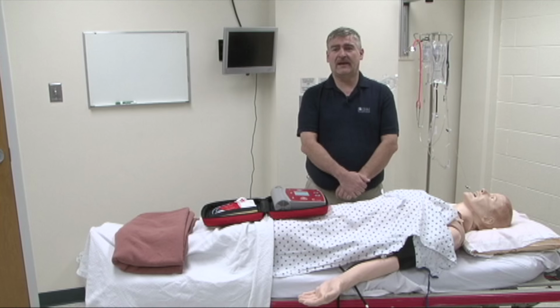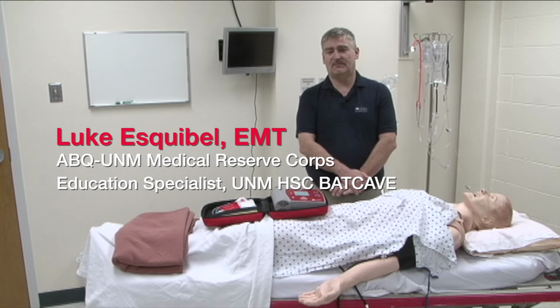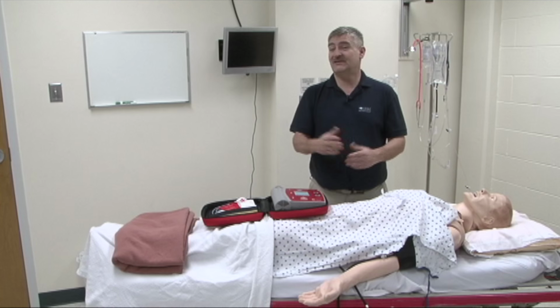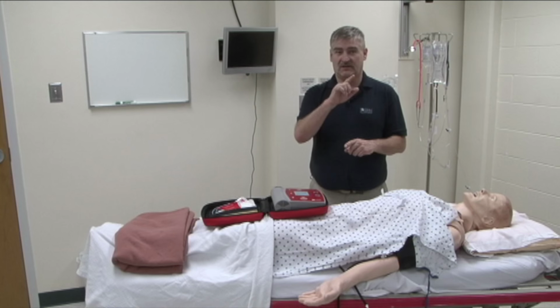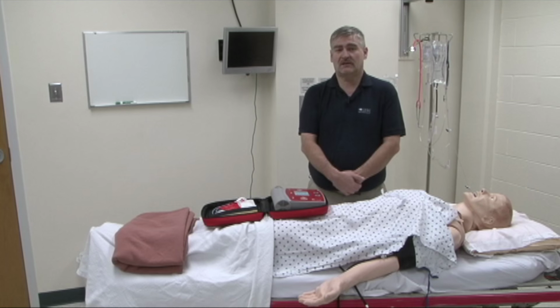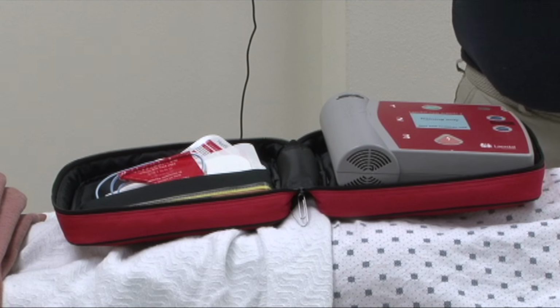Today I'm going to be talking about AEDs, Automated External Defibrillators. The AED is a PAD program, which is public access defibrillation. AEDs are everywhere. They're in schools, they're in police cars, believe it or not, they're in shopping malls, they're on airplanes. Anywhere you see a sign that has a heart with a lightning bolt through it, you can find an AED. AEDs were specifically designed for people who didn't have any medical experience whatsoever, so anybody can use this device.